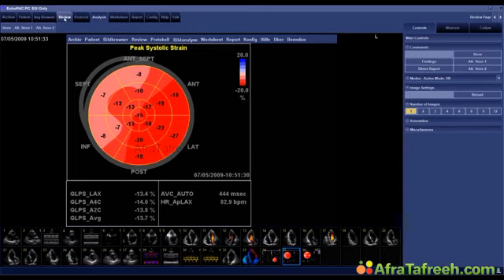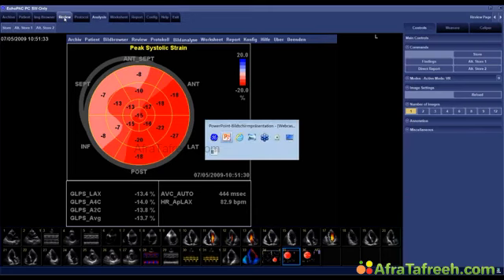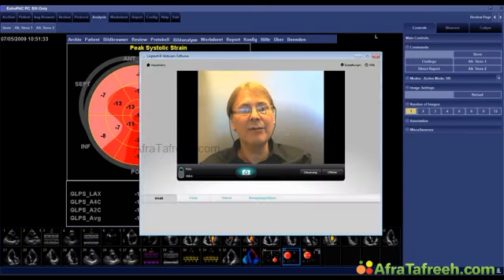We have compensatory function here of the lateral wall, but global longitudinal function has actually dropped. Now, what did we tell the pilot? Well, he was still doing fine. He had no symptoms. He was doing perfectly okay. He was actually still very, very good with his exercise capacity. As a matter of fact, he was now also much into mountain biking and other extreme sports. And he said, well, I don't have any problems.